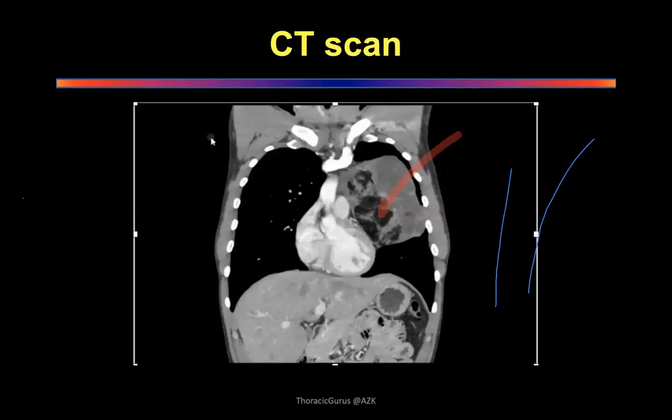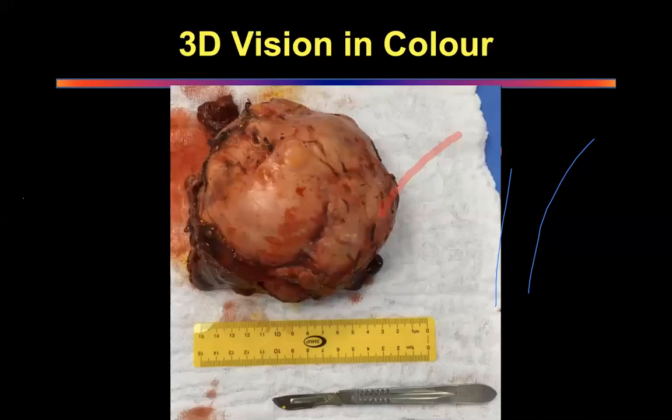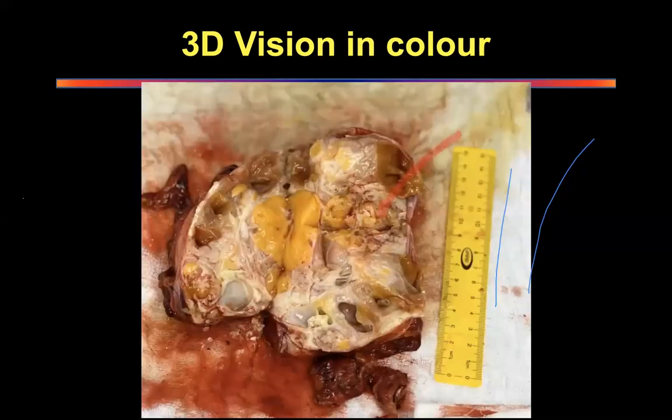So if you look at all these things inside, these cavities or calcifications and whatever else you see, when you're sitting in your clinic seeing the CT scan, because we are surgeons and we operate in the chest, we have a good mental image of what tumors look like. So every time you look at the CT scan or the chest X-ray, I want you to physically and mentally get an image of what the tumor looks like in real life and what is going to be inside the tumor. So this image must form in your mind.